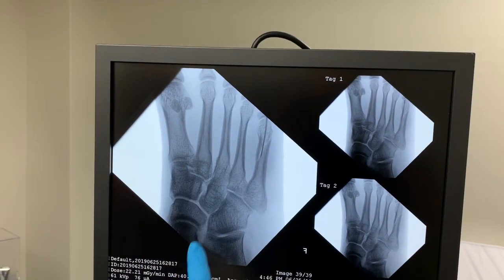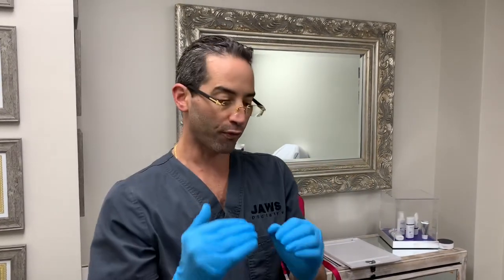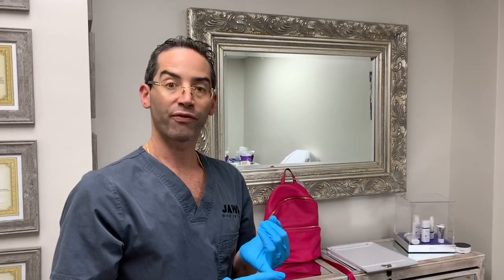The fracture is a spiral oblique fracture — it goes from here around to the other side. There are two parts of the fracture we can't fully appreciate in this view, but if I turn the foot a different way everyone will be able to see the other side. A lot of people ask — and the patient asked — how much faster is the fracture going to heal with the PRP? We're all different. What may work for her may not work for someone else. We're delivering this bolus — an unbelievable waterfall of growth factors and proteins — right into the fracture site.